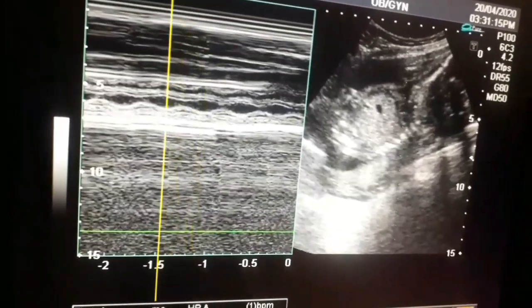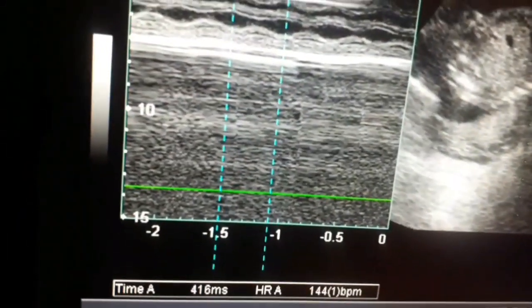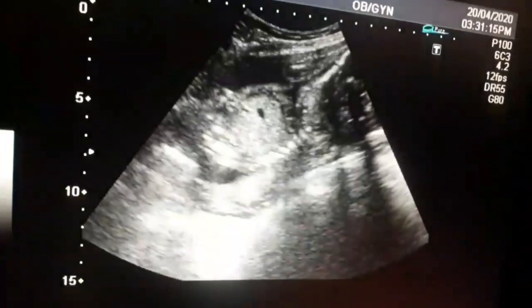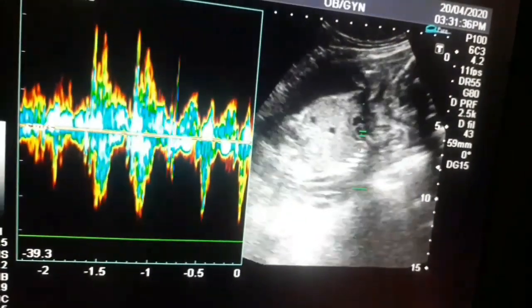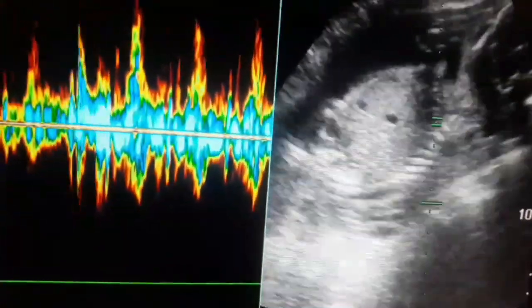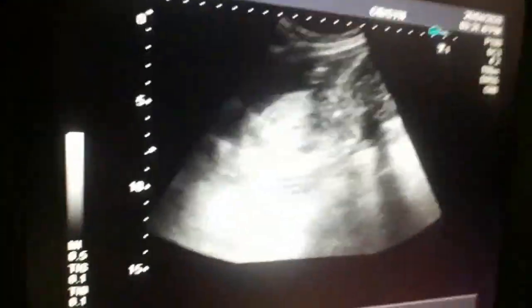This is the fetal heart rate in the waveform — from one wave to the other wave — and it is about 142 beats per minute. Now I am hearing the fetal heart sound by placing the cursor on the fetal heart. This is the waveform of the heart.